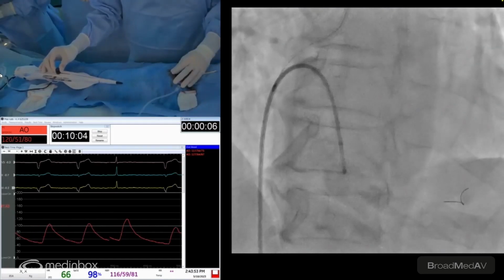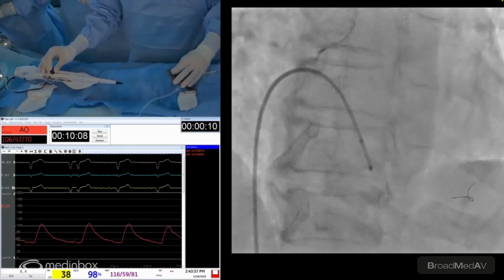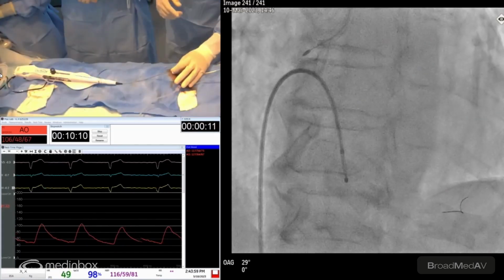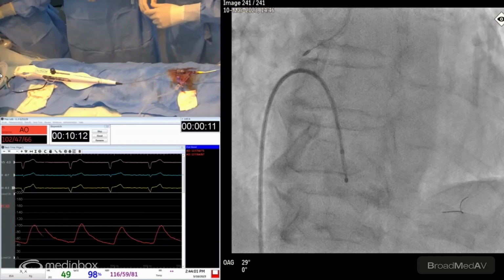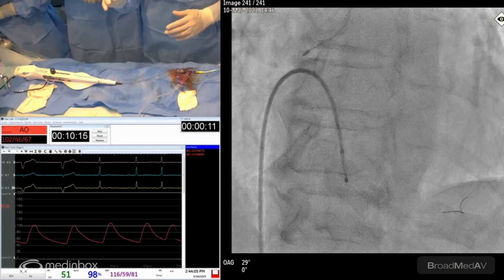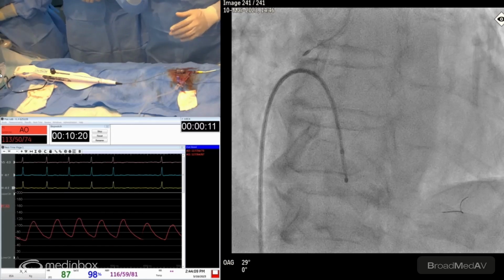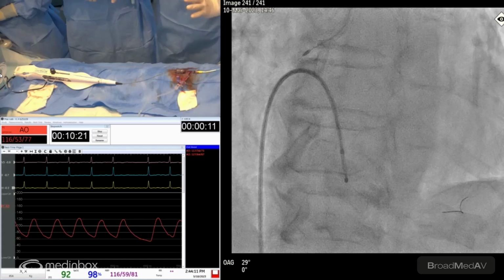So I'm having resistance at the mid segment. You can see here, the patient becomes dependent on the pacemaker. So I think we made a very good choice. It was a good call from the beginning, because we had bradycardia, heart rate was between 50 to 60, and you hear the sound of resistance of the lesion. Right. I think it was a good choice.